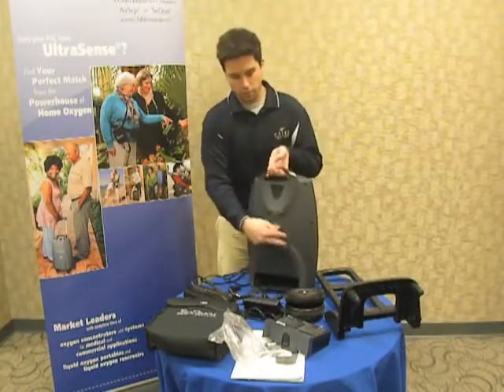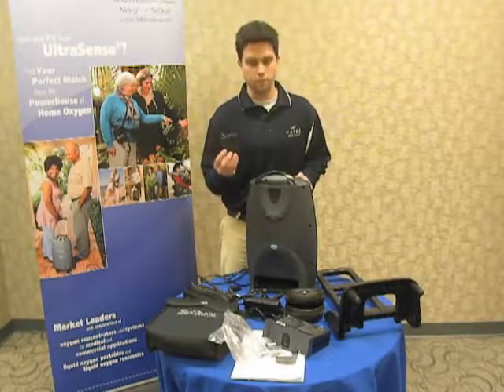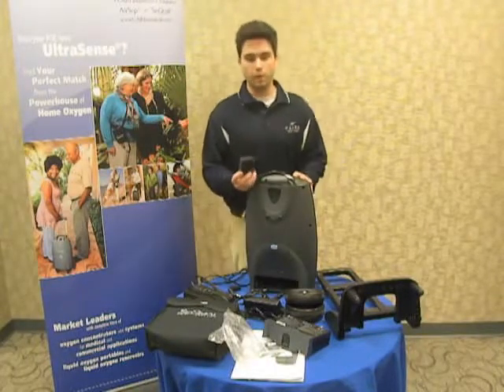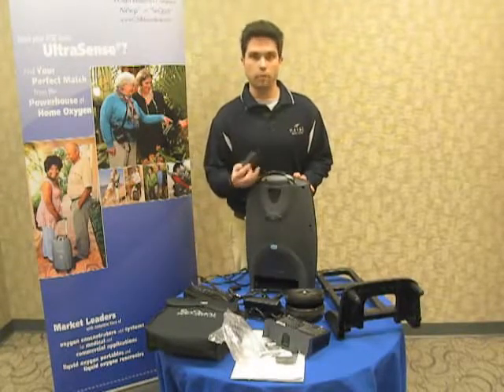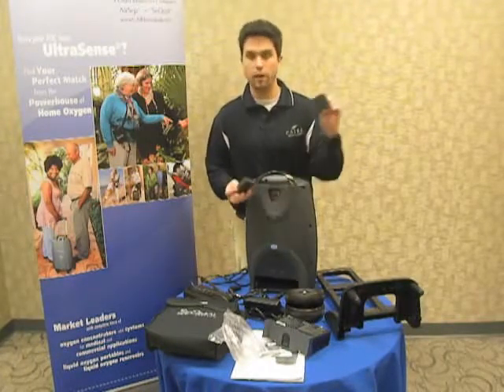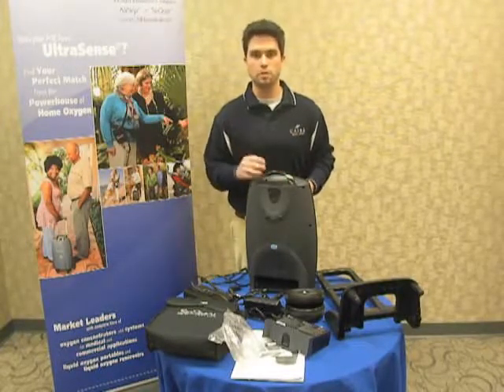Now on the back of the SeQual Eclipse is the intake filter where air actually enters the unit. We provide you with a spare one of these with the machine so that you can clean the one out. Part of your weekly maintenance of the machine is to clean your intake filter. You wash it with soap and water, and it does need to be dry before you put it back in the unit. So we provide you with a second so you can swap it out and wash this one. While it's drying and being washed, replace it with another filter. Again, that should be done once a week.